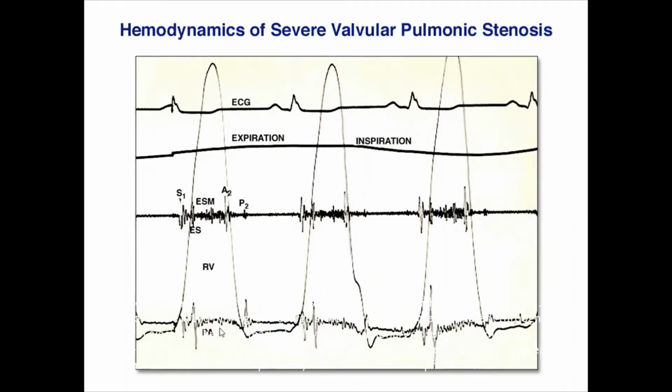The scale is not given, but what else is given here? ECG, respiratory phases and phonogram.